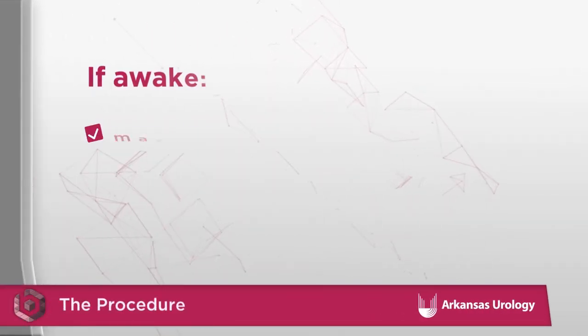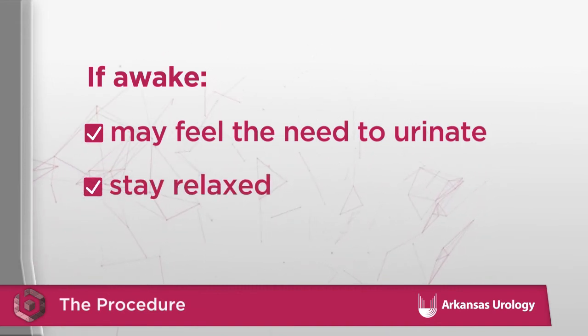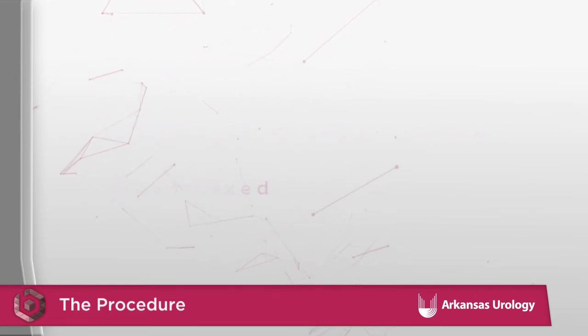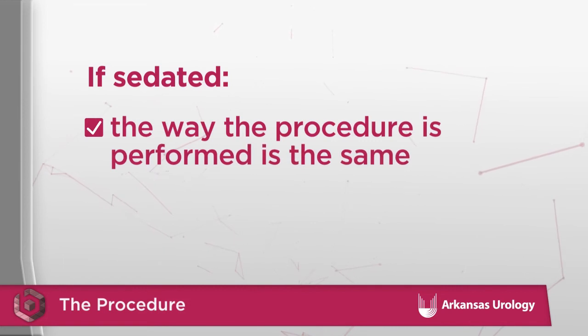In order to get a good view, the bladder will be filled with saline. If awake, a patient may feel the need to urinate, which may cause minor discomfort. The more relaxed a patient can be, the easier and less painful the procedure will be. Again, the procedure only takes about 2 minutes. Some patients prefer to be sedated because of the anticipation of the procedure and the fear of it hurting.